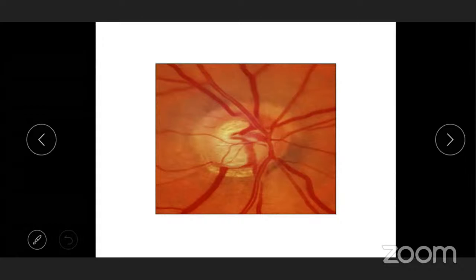And Chitra ma'am, this is the last slide I have. The disc margin, always look for that. Then the disc size. Then you define the rim dimensions in all the four quadrants. Then look at the rim color. Then the RNFL defect, followed by the parapapillary atrophy, the beta zone. And then you look for the blood vessels and the disc hemorrhages if there are any. And lastly, you look at the asymmetry.